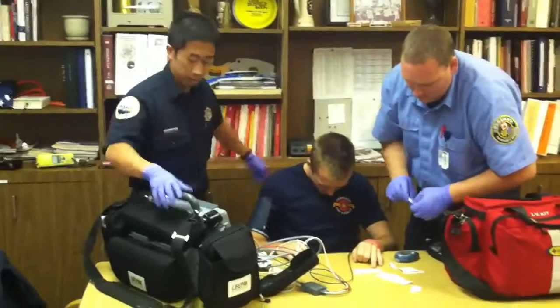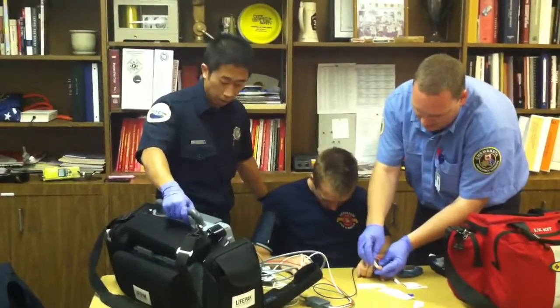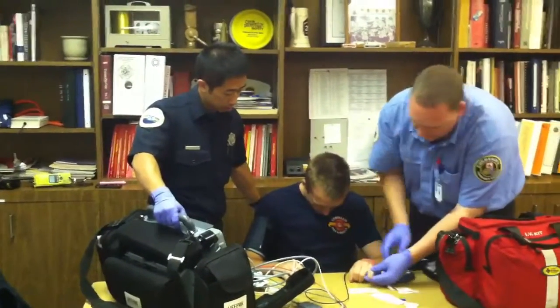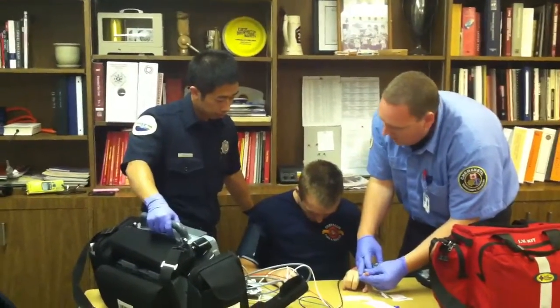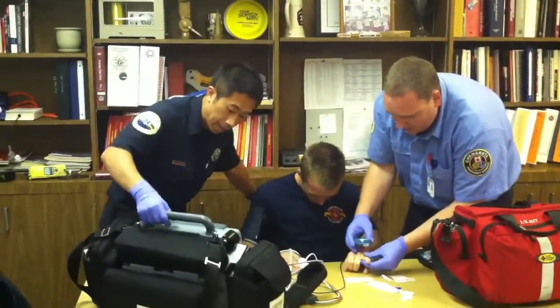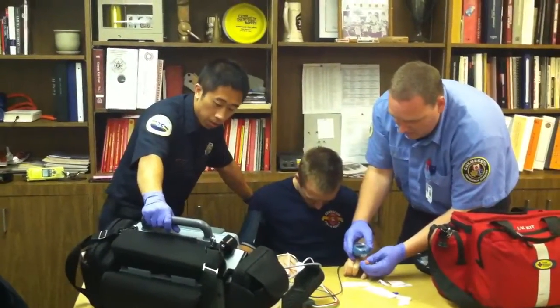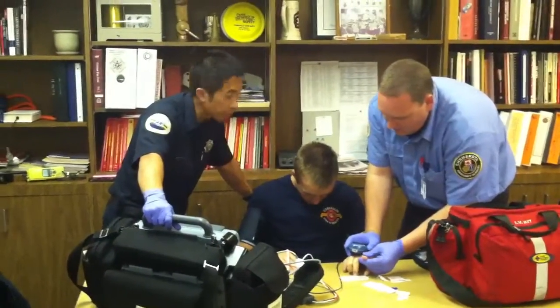All right. Oxygen saturation is at 100%, so we got an O2 out of the way. Sharps on the table. Get some blood. Why don't you go ahead, you got the 4 lead going on there? I got the 4 lead going. Okay. So what are you seeing on there? It looks like a normal sinus rhythm. I see no ectopy or anything at 65 a minute.